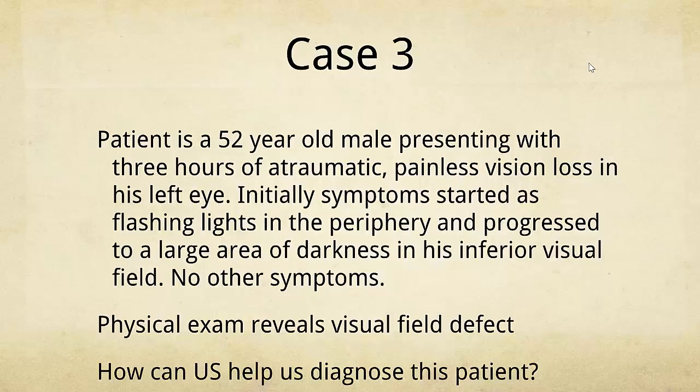That's one of the ones we need to know about because we need to call in ophthalmology, because the person might potentially need to have their retina tacked back down. However, we're pretty limited due to our lack of dilation and other confounding factors. Again, fundoscopic exam is going to be challenging.